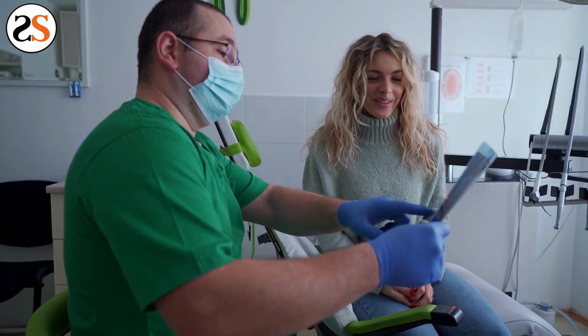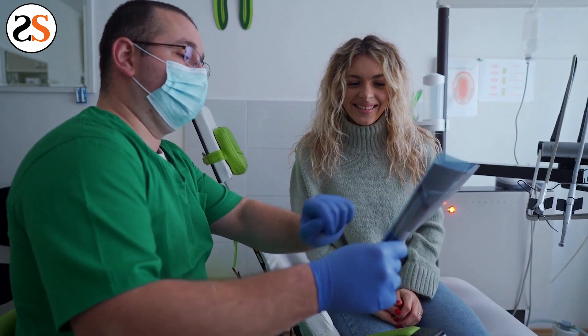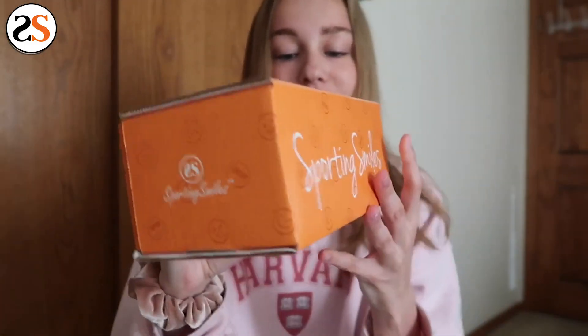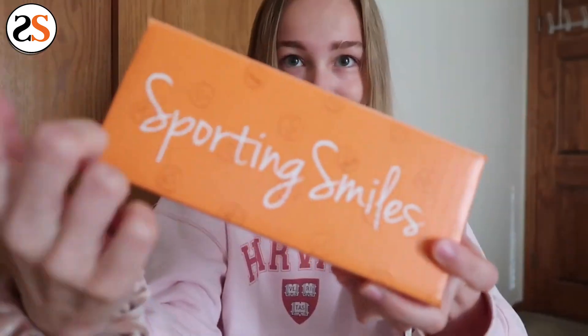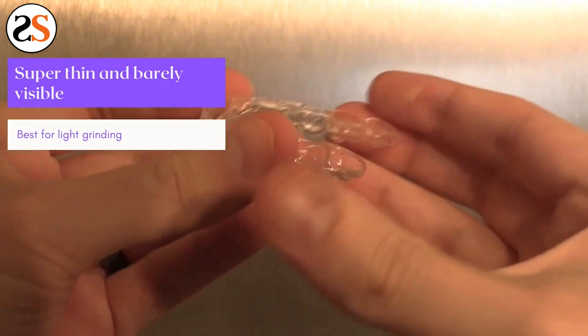You'll need further protection or risk serious dental damage that will be very expensive to repair. Your dentist can create a bite splint for you, but it may cost you hundreds of dollars. Sporting Smiles is an online dental production company that crafts the exact same bite splints that your dentist would make at half the cost. By ordering online from Sporting Smiles, you can receive a custom bite splint in two weeks, whereas if you receive one from the dentist, you'll likely have to make a follow-up appointment to receive it.